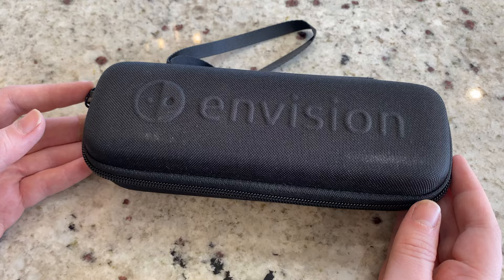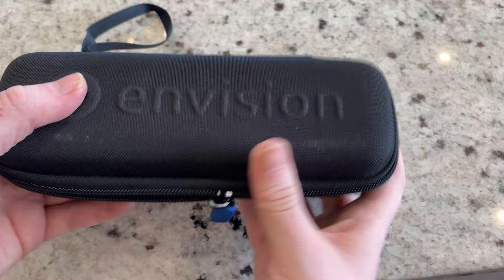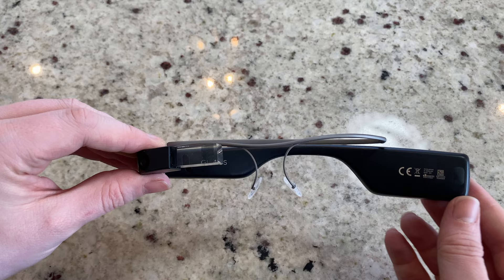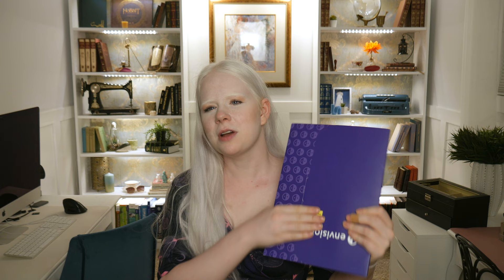Opening up the cardboard box, we have this lovely little glasses case that says Envision in raised font on the top. It also has a carrying handle or a strap that you can loop your hand through. Opening up the zipper, we see our Envision glasses. The top of the case has a zipper pocket where you can store the USB to USB-C charging cable that comes with the unit.